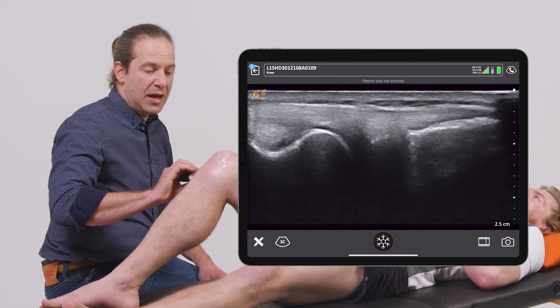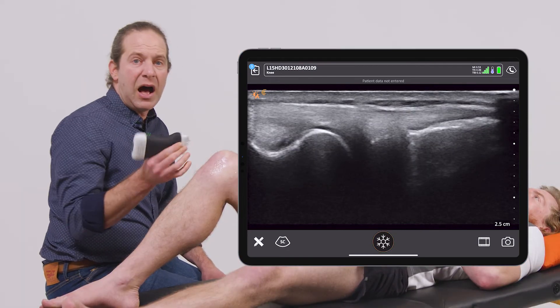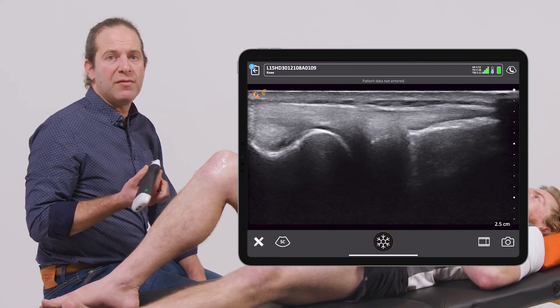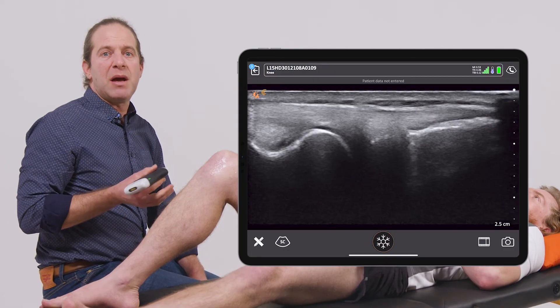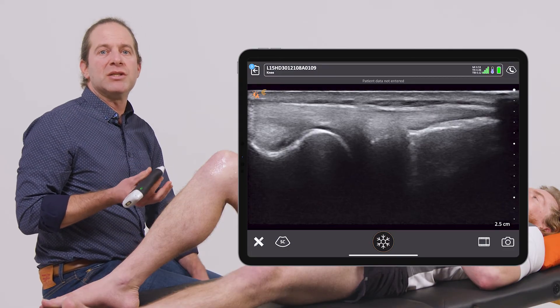And with a quick scan I can get a high degree of confidence in some of the pathologies that might be causing my patient's knee pain.